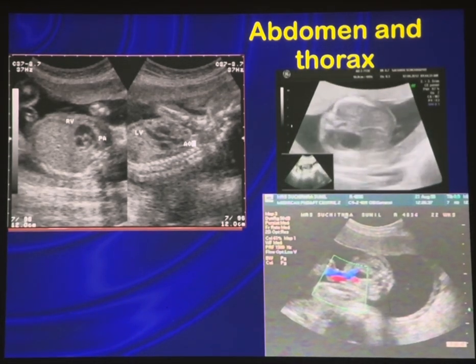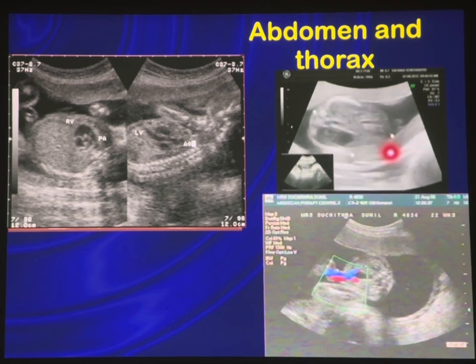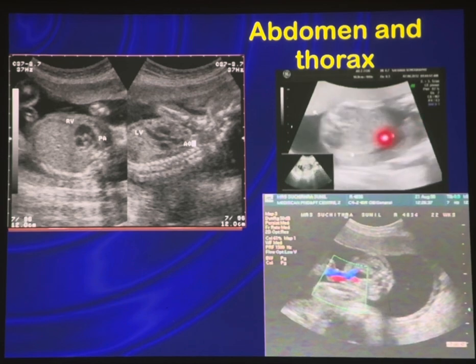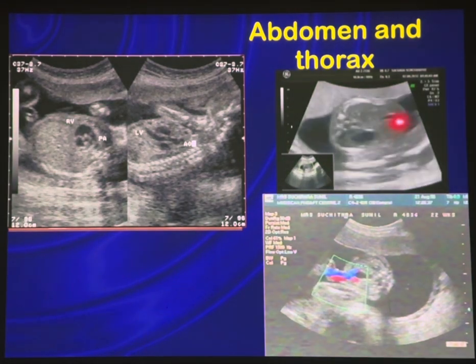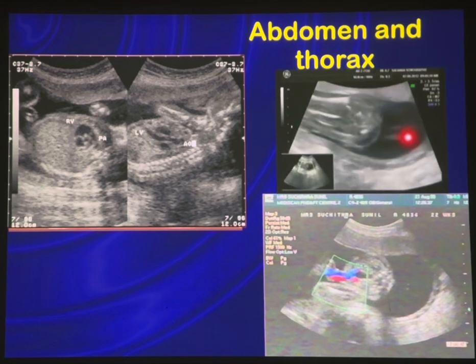again see the zoom. You can see the stomach bubble, posteriorly there is the spine, anteriorly there is the hepatic portion of the umbilical vein, and you have to measure the abdominal circumference over here. Then see for entry of the umbilical cord. The umbilical cord is going inside. No omphalocele, no gastroschisis, no anterior wall defect, no ventral defect.